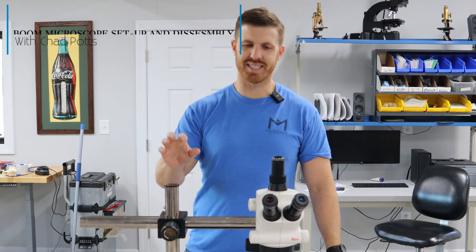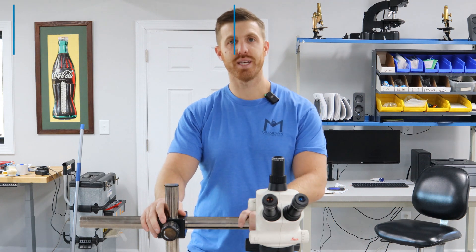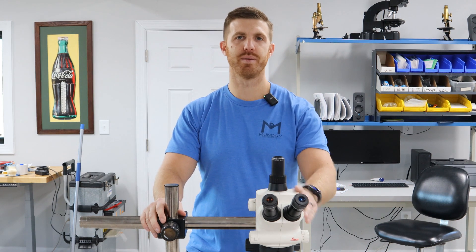Hey, this is Chad with Munday Scientific. Today we're gonna take this Leica S6D on a boom stand and we're gonna disassemble and reassemble it to help you whenever you buy one.